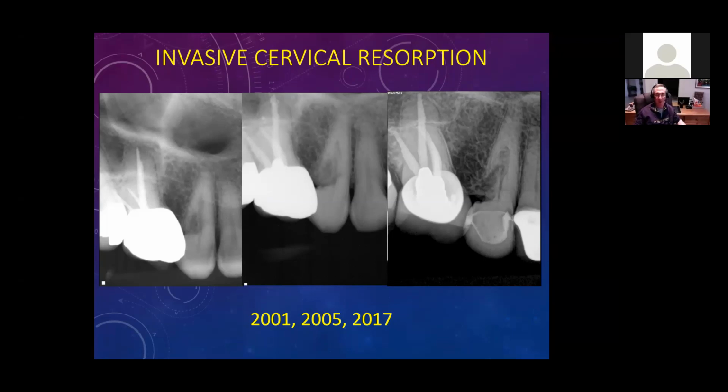So does that mean as a rule you won't treat external resorption unless the patient is symptomatic? Generally speaking, that's true. It depends on how accessible, how extensive the resorption is. For the small ones, when they're asymptomatic, if they're accessible and easily treated, we'll generally treat those. I'll show you some examples. When they get big like this, I mean, this looks terrible, and we're trained as dentists: well, don't just stand there, do something. But the best thing I've found in this situation is don't just do something, stand there. Because many of these will last for many years without doing anything.